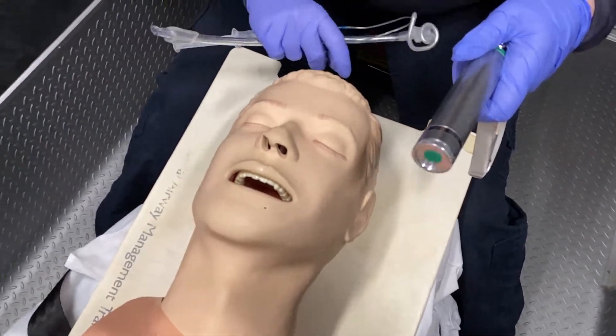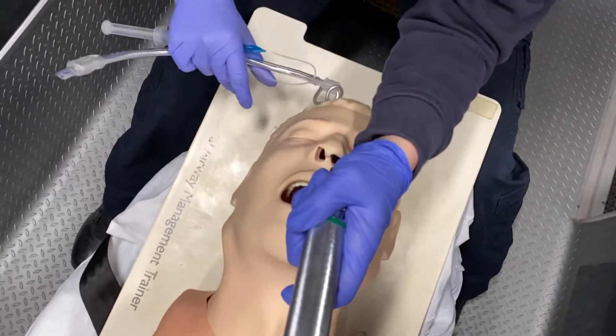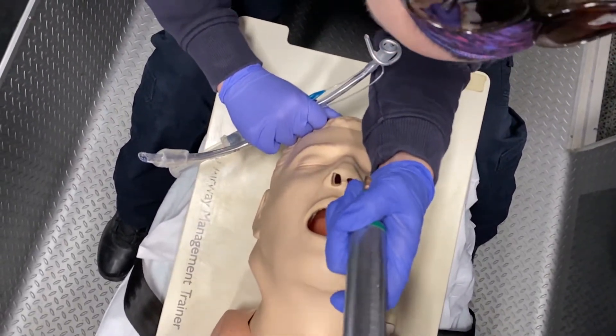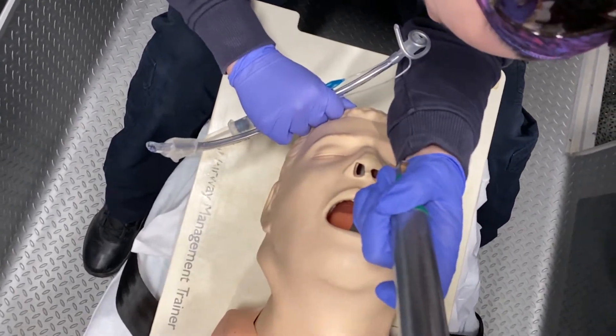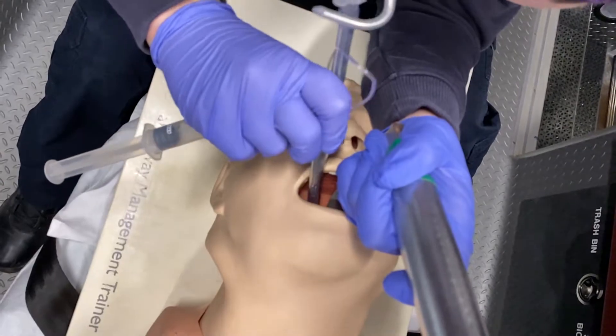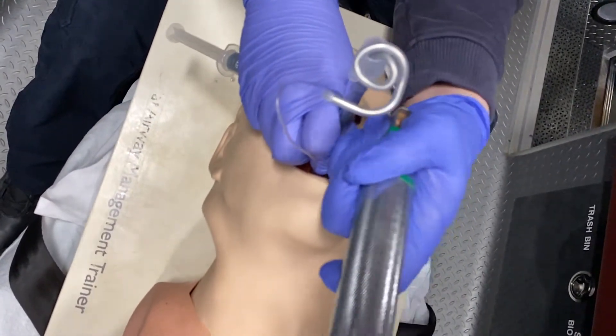Now we'll go ahead and do this in real time. I'm going to tilt the head back and place my laryngoscope. I'm going to visualize the vocal cords — this curved blade is made to go into the vallecula. I'm going to watch my tube pass through the vocal cords and insert it another one to two centimeters.